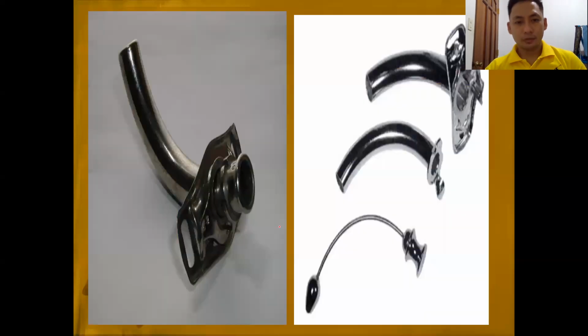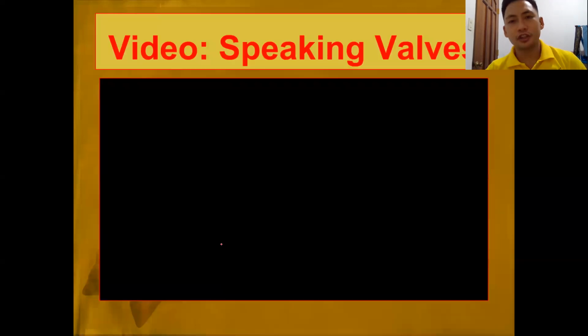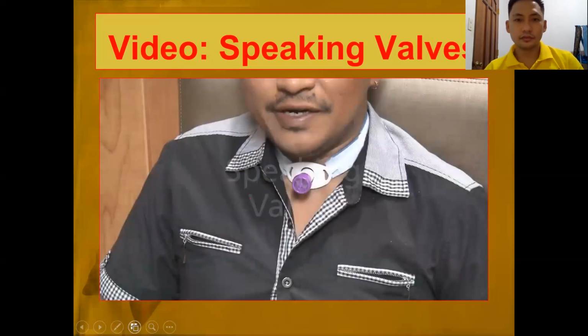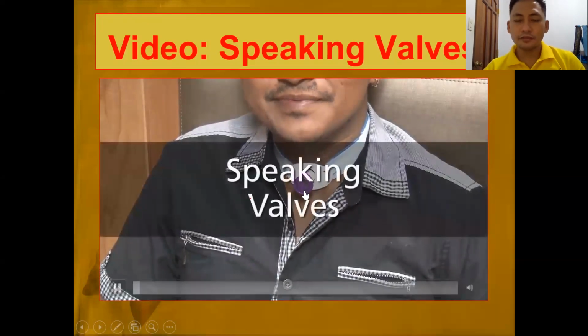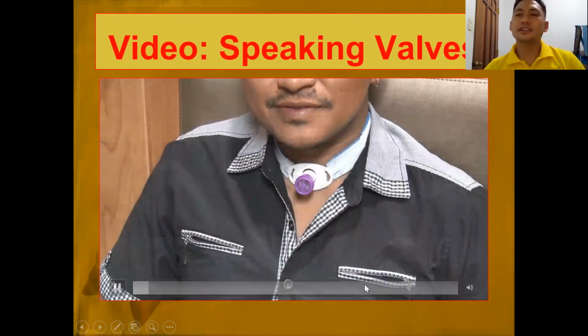Okay. We also have metal tracheostomy and we have talking tracheostomy. May pre-press ka lang na port para ang air lalabas doon sa upper respiratory tract for you to speak. We also have modern speaking valves. Ayan, ina-attach lang sa tracheostomy.